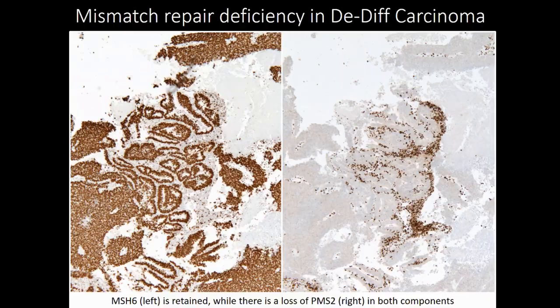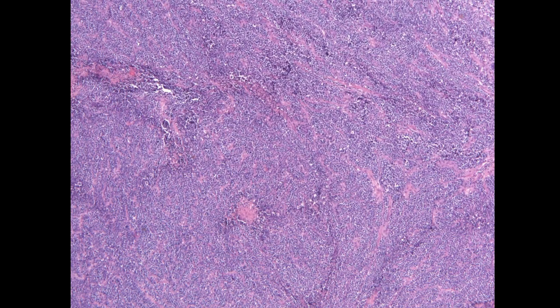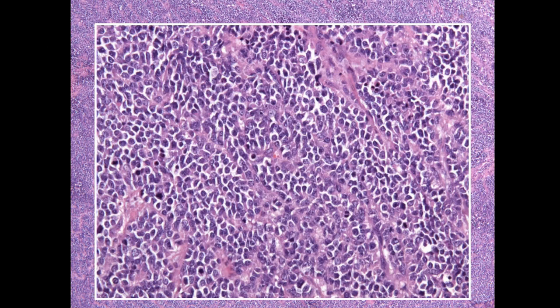Here's another example of one of these tumors, and you can see that this is just a sheet of cells with absolutely no defining morphologic characteristics, just small blue cells packed throughout. I mean, for all you guys know, this could be a picture of a lymph node with lymphoma in it, right? And if you take a closer look, you've got these small cells predominantly composed of nucleus with very scanty cytoplasm that's somewhat eosinophilic, and then no gland formation anywhere. It looks very discohesive. This is actually an undifferentiated carcinoma. But again, it should look exactly like a lymphoma or a melanoma metastasis to you. These tumors are often very hard to define morphologically.